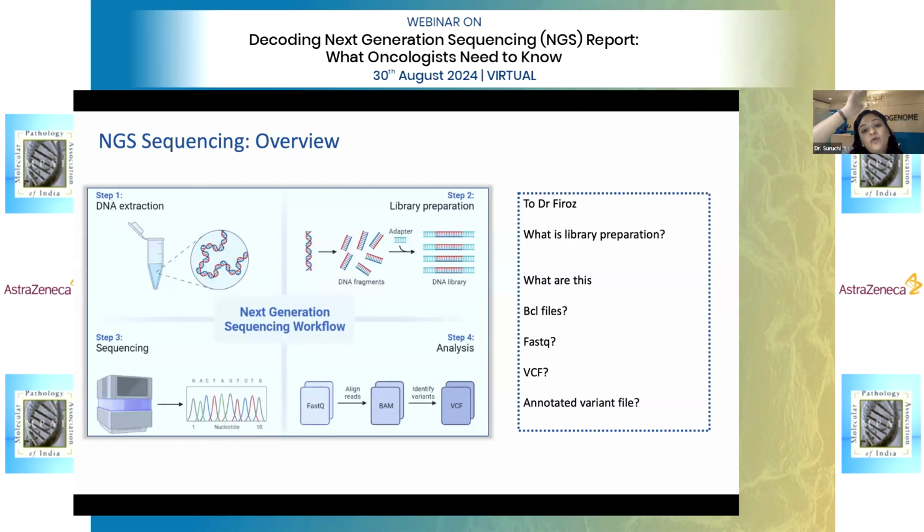So the breakpoints can be in intronic or non-coding regions. However, most panels, whether DNA or RNA, are designed on exonic or coding regions. So if the probes for those breakpoints are not included in the DNA panel, the fusion is bound to get missed.